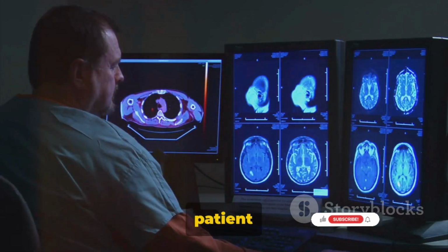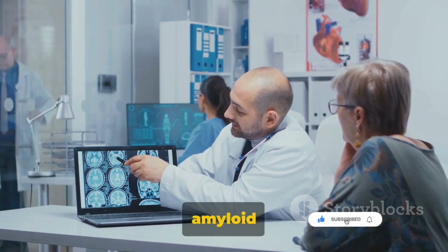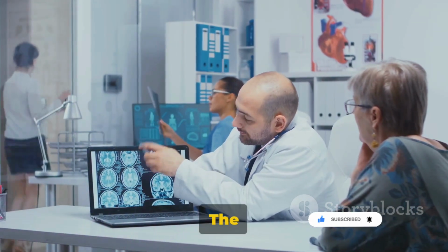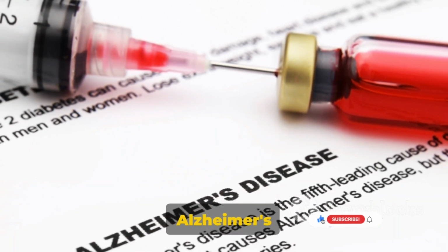For instance, a patient with suspected Alzheimer's disease underwent a PET scan with a radiotracer that binds to amyloid plaques, the hallmark of Alzheimer's in the brain. The PET imaging confirmed the presence of significant amyloid deposition in the brain, supporting the diagnosis of Alzheimer's disease.